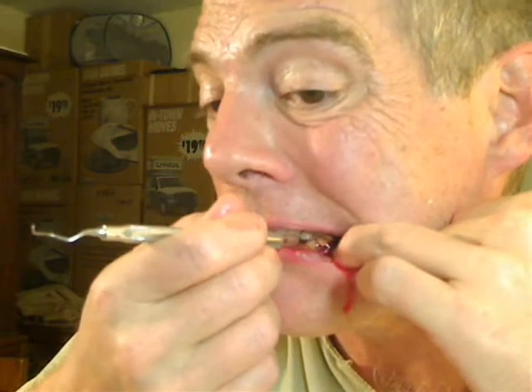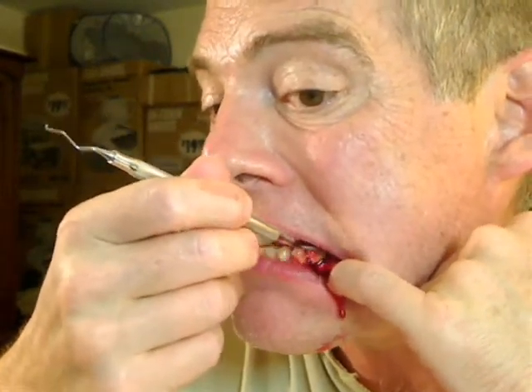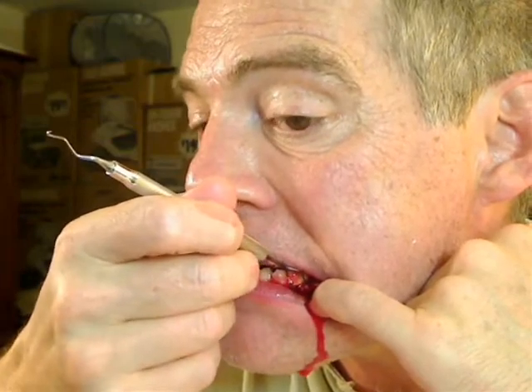Certainly the back one wants to bleed some, and I'm going to try to help it. What you can figure is going to happen is that this will bleed for up to several hours. Once it bleeds clean, it's not completely gone, but it's definitely a good start. If I can do any cleanup, that's a good thing too. There's like a giant blob — but more important than the scraping are these giant blobs. These could be big blobs of blood that have gone in and coagulated, rather than things that were there before. But in the process of coagulating, they absorbed nasty things. This certainly looks ugly now, but once it stops bleeding it's not going to look so ugly.